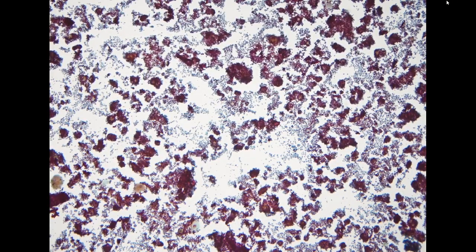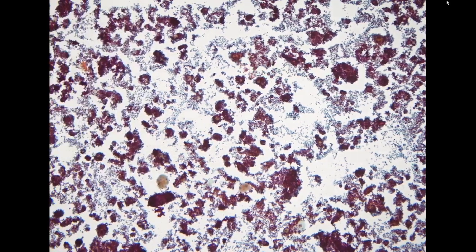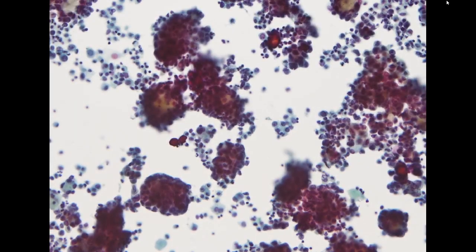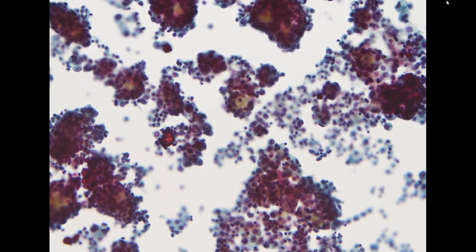the surgery. On low power, you can appreciate that there are many cells, so hypercellularity, and additionally, you can see a lot of cells are in these large cohesive clusters. At this power, you can already appreciate some round small material as a core in this cluster. When we go to higher power, these are likely psammoma bodies.